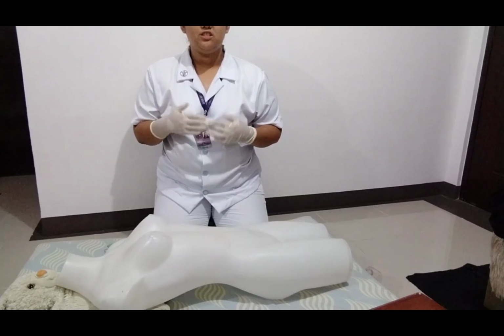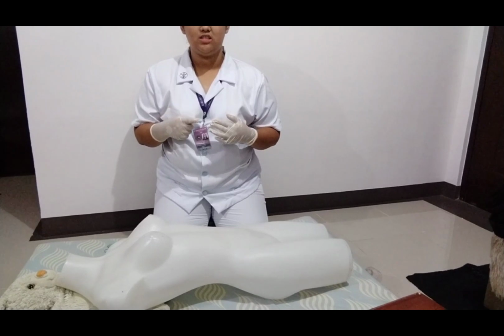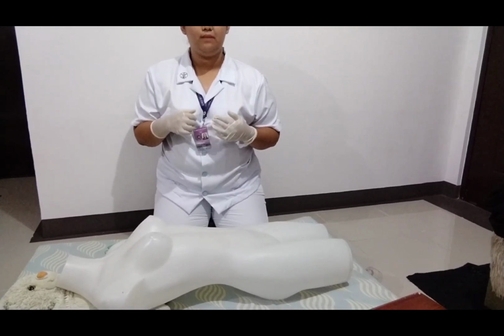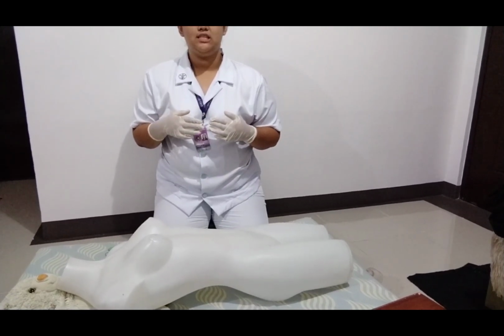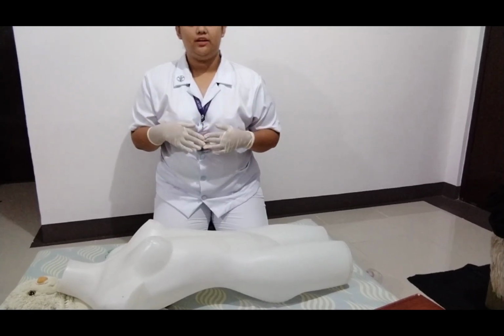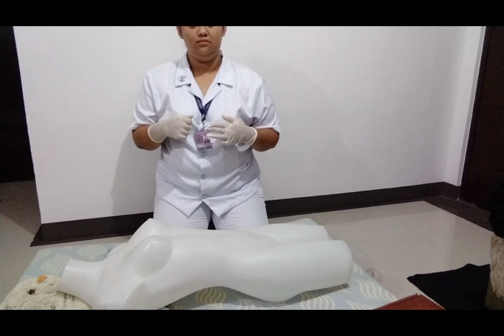If the patient's chest is hairy, we'll have to quickly trim the areas where the AED patches will go, because hair will act as a barrier, and then the AED might not be able to deliver the shock. So the AED, also known as the automated external defibrillator, is a complex yet simple to use medical equipment that analyzes the heart's rhythm, and if necessary, administers the electric shock or defibrillation to help the heart establish an effective rhythm.